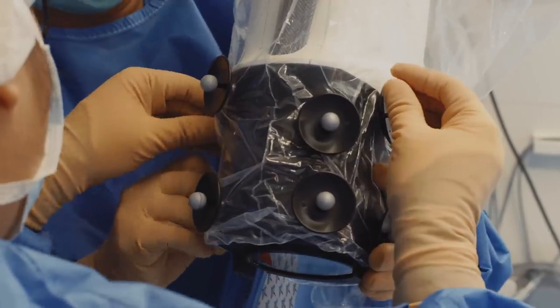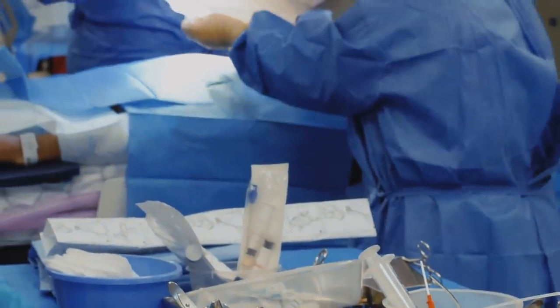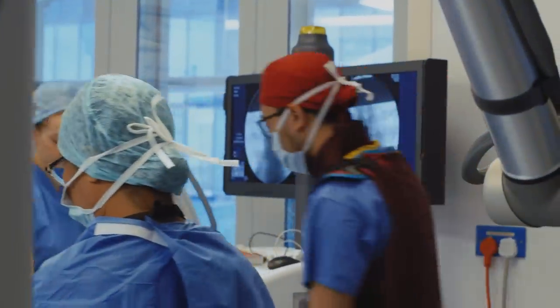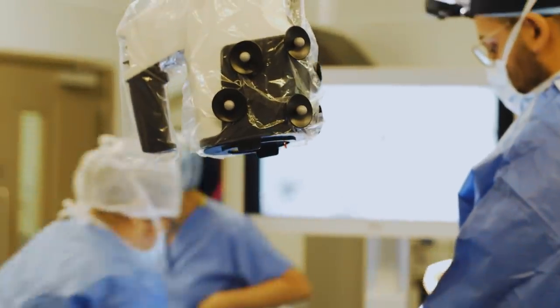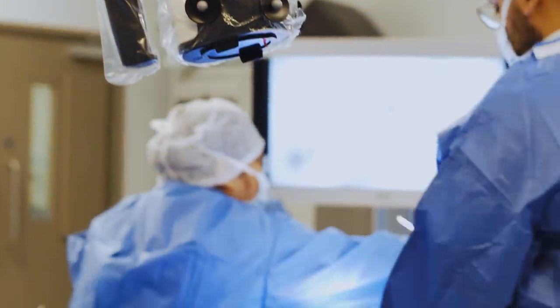Cases like this require an experienced theatre team who'll get things like the exoscope and all the operating instruments set up. Everything needs to be like a well-oiled machine and running smoothly. So whilst we get the first x-ray to show us exactly where we think the bullet might be, we start to prep and drape the patient and get everything ready for surgery. Here you can see the exoscope getting into position and we're ready to start.